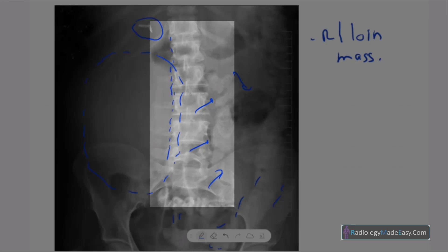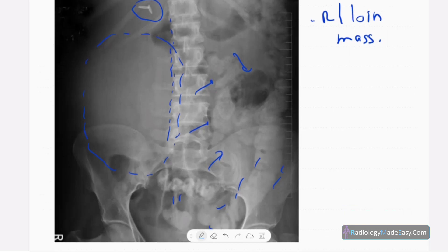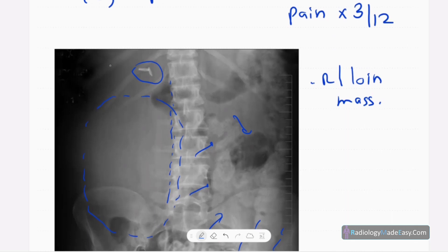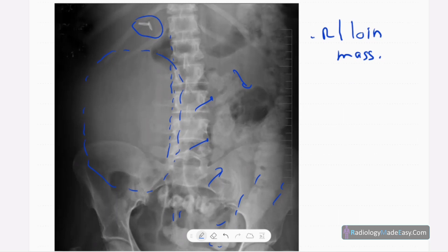The scoliosis is due to mass effect — this appears to be a chronic, likely neoplastic process causing scoliosis of the lumbar spine due to pressure effect. You do not see any bowel obstruction, no portal venous gas, and no free air within the peritoneal cavity.